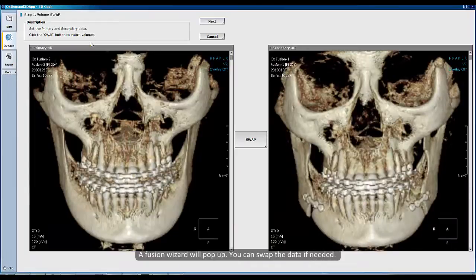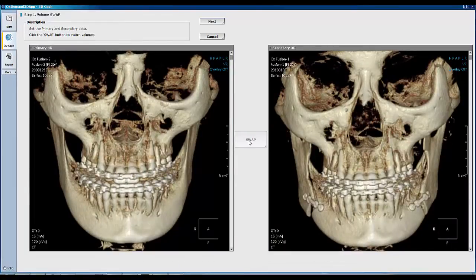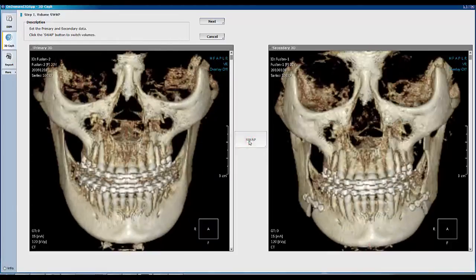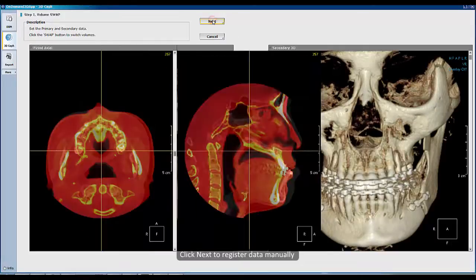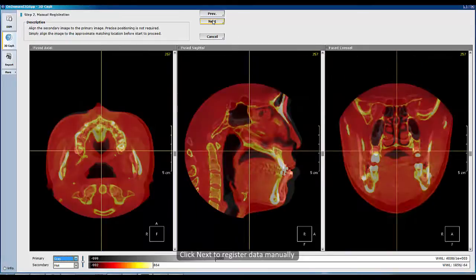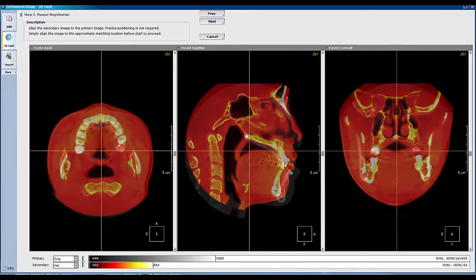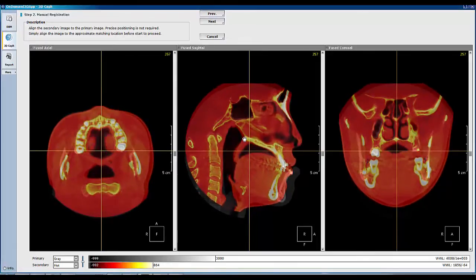A Fusion Wizard will pop up, and you can swap the data if needed. Click Next, and now register the data manually. Click Next again to proceed.